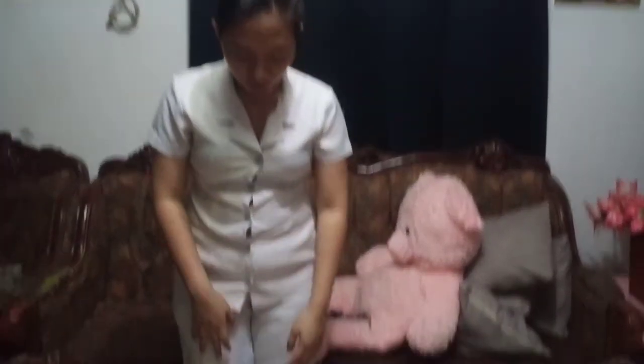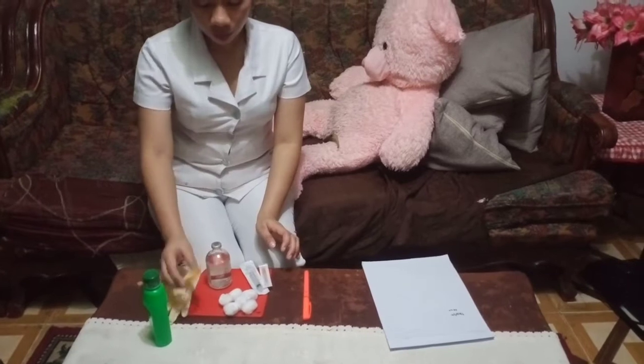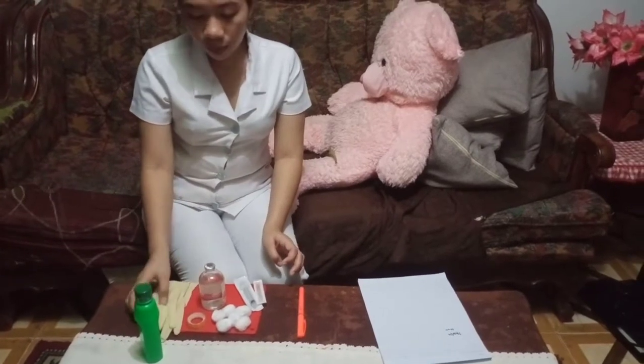Now we're going to organize the equipment. To save time and effort, we have a syringe, cotton balls, band-aid, vial, clean gloves, and alcohol. Now we're going to perform hand hygiene and observe the appropriate infection prevention procedure. So I'm doing hand washing.